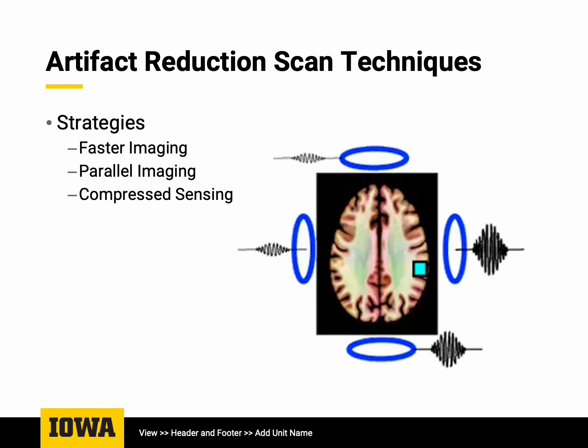With faster imaging sequences, we can increase the probability that spontaneous motions won't be a part of the immediate scan window when we're acquiring data. In cardiac imaging, increasing the sequencing speed helps us to gain more data in each small gated window that is acquired. However, the trade-off is that there will be a limited spatial resolution. There's no free lunch is a common phrase in this field.